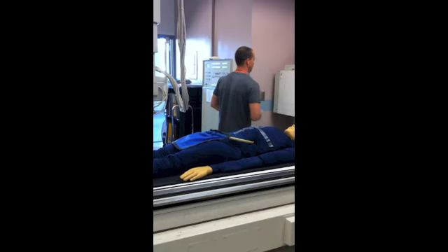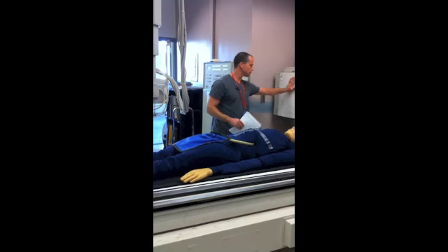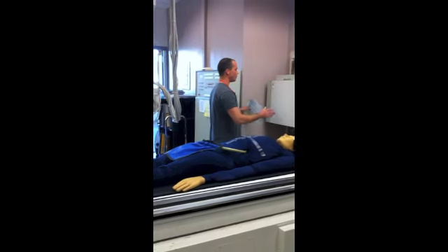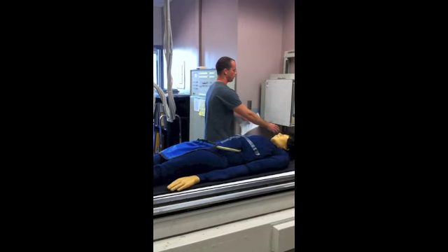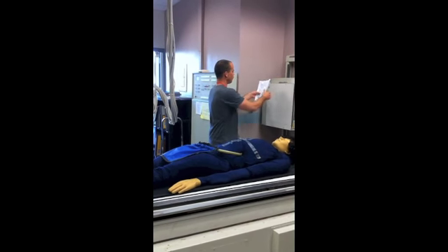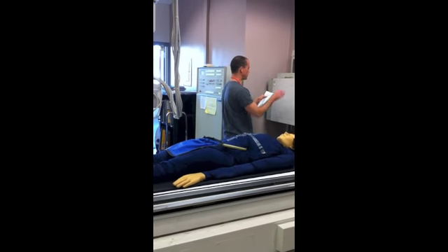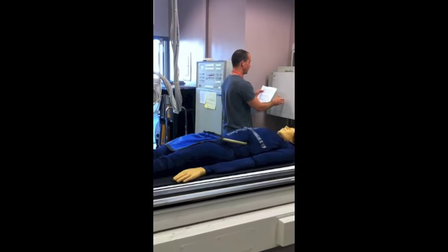Now we're going to have the patient stand up against the board, chest lightly up against the board. I'm going to have the patient roll his shoulders forward, take the back of the patient's hands, put them on the patient's hips, move forward, and the patient's mid-sagittal plane should be centered to the midline of the IR.